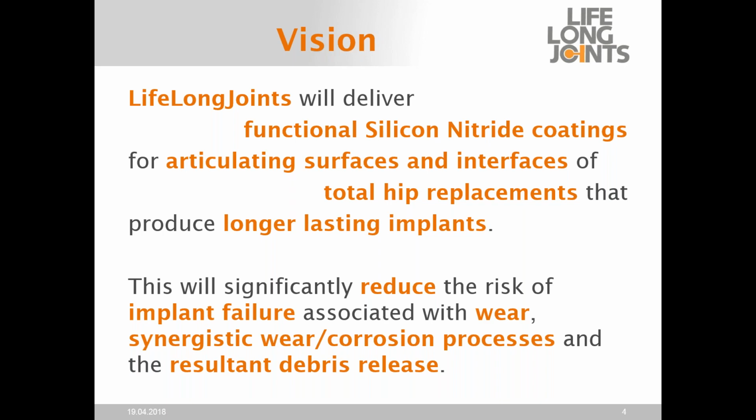And one thing that we wanted to do, as well as develop a new type of coating for these prostheses, was also to develop new test methodologies that didn't just focus on the average or the median environment of a particular hip replacement, the loads and motions that are applied to it, but also looked at the more extreme cases, the stumbling, the walking upstairs that a patient may do, and doing so would challenge a hip replacement.